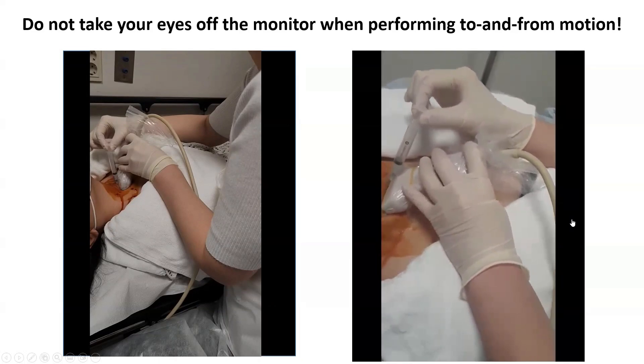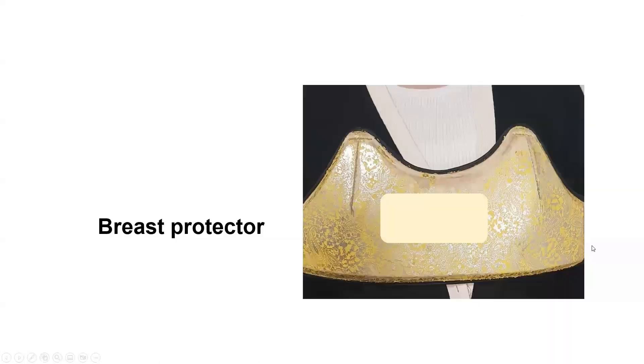To fix the posture, the examiner must be in close contact with the patient's body. When a male doctor does FNA on a female patient, he always uses a breast protector in my hospital.